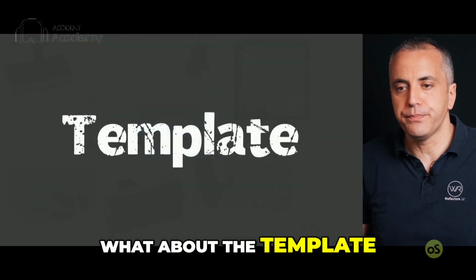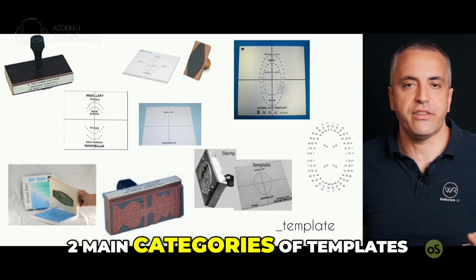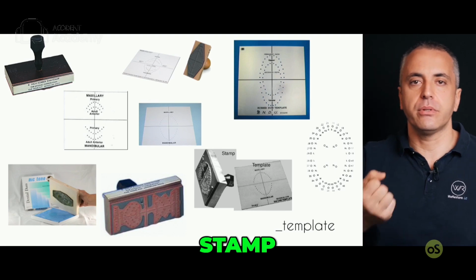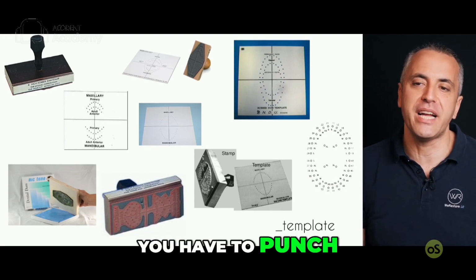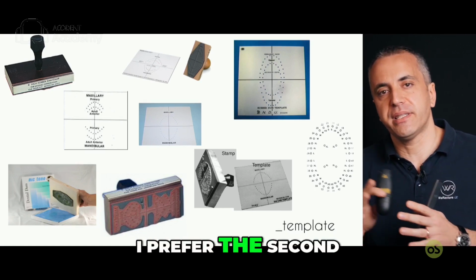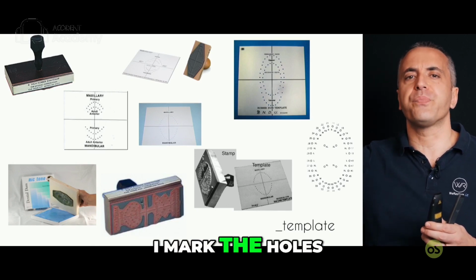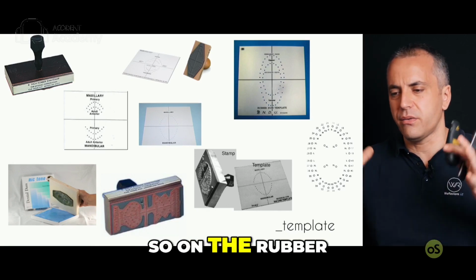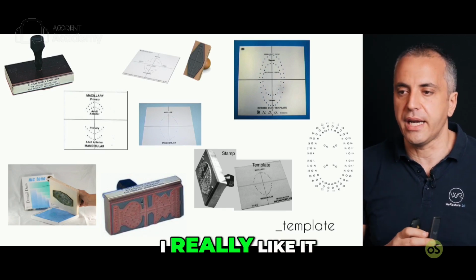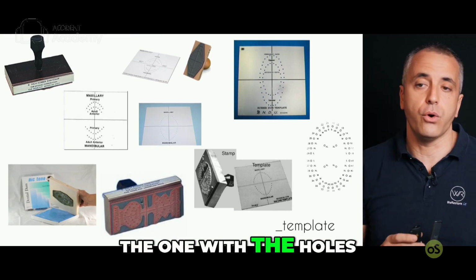What about the template? Template is something very useful, and there are 2 main categories of templates. One is the stamp, so you make the stamp of the holes you have to punch, and the other one is just a template with the holes. I prefer the second type because with the first type, there is the ink, I mark the holes that I don't want to punch, so on the rubber dam you still have the points marked, and I don't really like it. So there are several types of template. I prefer to use the one with the holes.